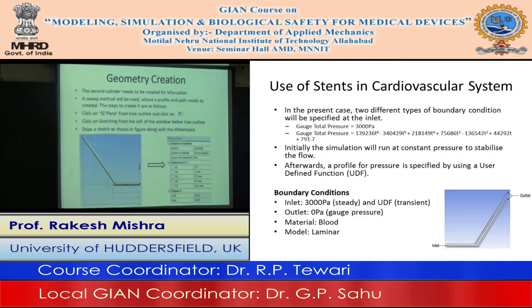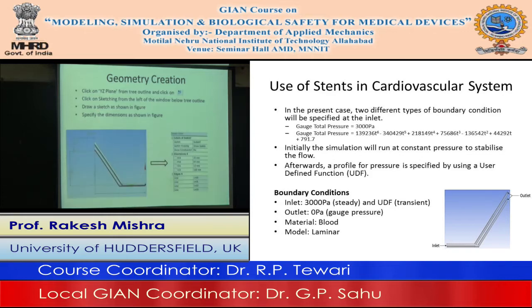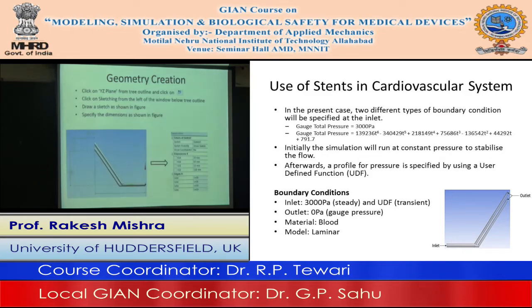Once it is done, we create this sketch, a straight line here and a straight line here. Then we sweep a circle along this. We go to sweep, we create this circle and we sweep this circle around this straight line and then this straight line. So once we do the sweep part, we get the final shape like this, but we want to make it sharp here. So what we do, we create a small sketch here and extrude along this so that we can cut it, and this is our final shape of the carotid artery that we have done last week.